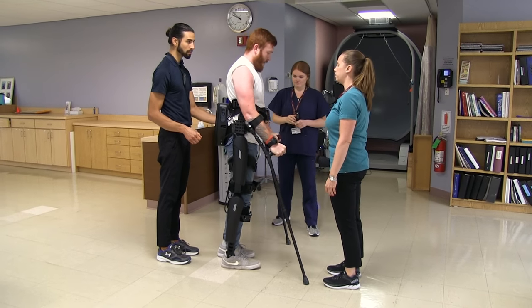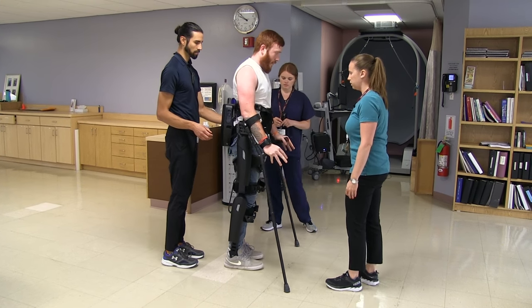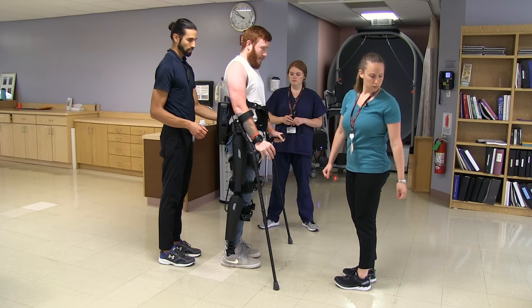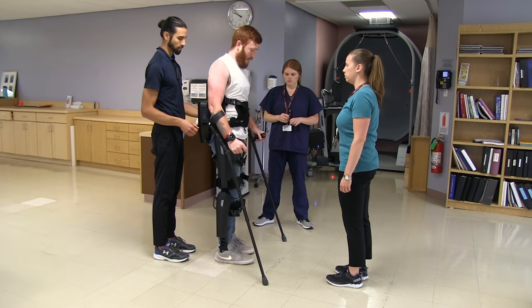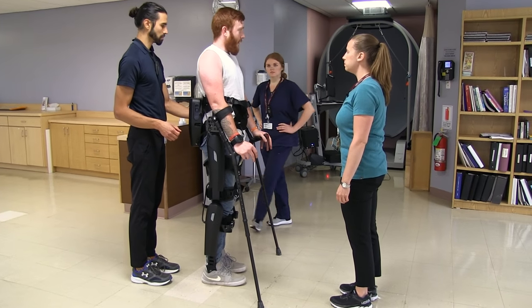Good — find home. Getting to home. Narrow from home. The therapist asks which side Keith wants to turn. Keith says he neglects the left a lot, so he'll try turning left.